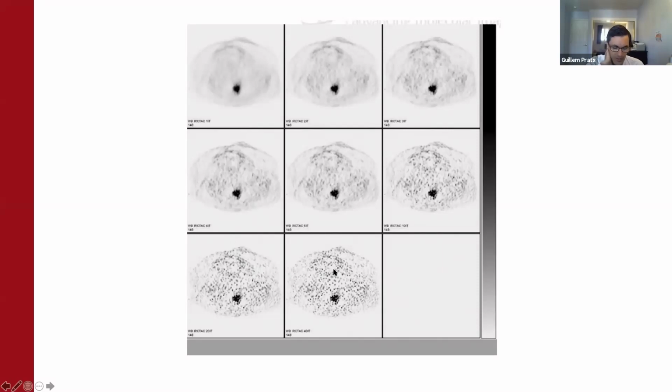So it's kind of interesting that the quality of the images coming out of those iterative methods depends on the number of iterations. And sometimes it may not be desirable to run a very large number of iterations because you can see here, this is the advanced number of iterations. The image becomes very noisy and has that kind of star-shaped pattern. You can see a lot of noise coming out. And actually an earlier iteration may have been better.